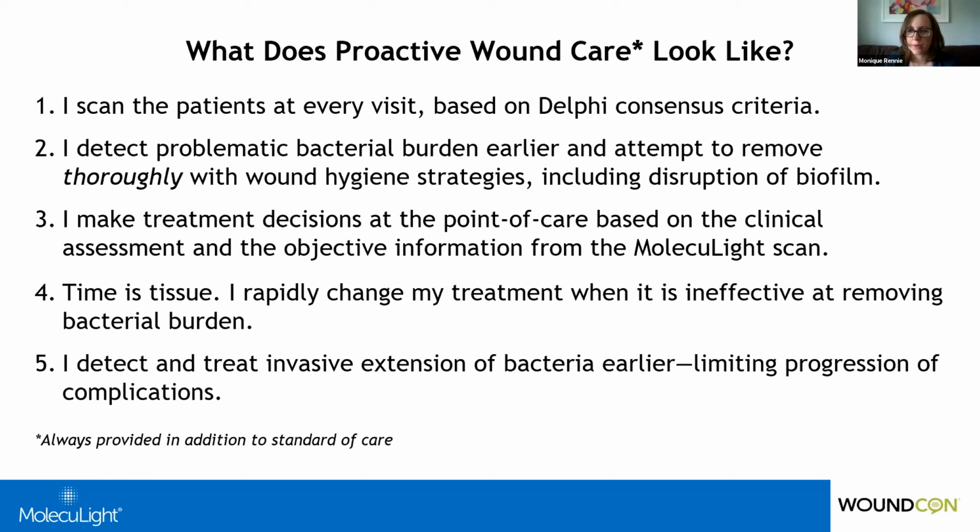I have one more question. What's been the reaction from your patients when you scan them? That is just an excellent question. Not only important from the standpoint that our patients know what we're doing. We show them the scan many times. They're able then to understand why more debridement is needed. They understand why we're starting antibiotics. And they're looking forward then to the follow-up where they can see the next scan to see if we've made progress.